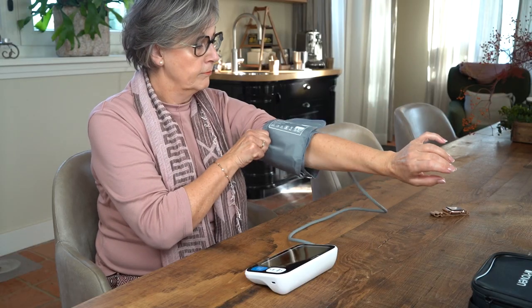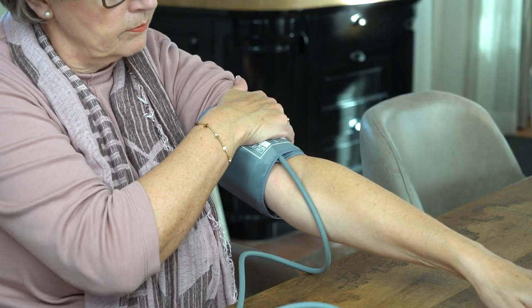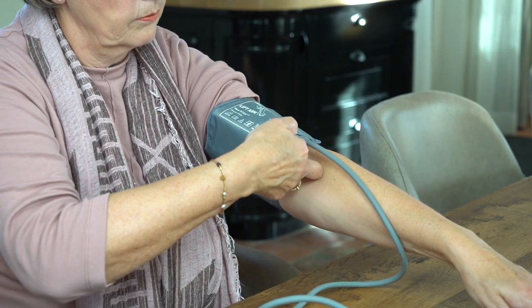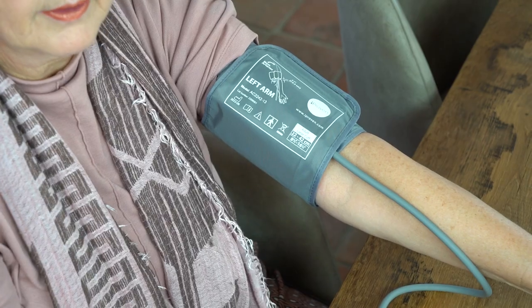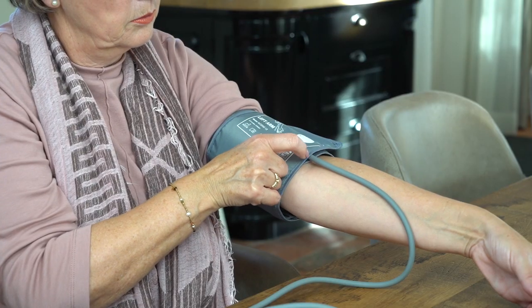When taking a measurement, correctly wrap the cuff of your BP monitor around your left arm, one inch above the elbow, making sure it is at heart level. Make sure the cuff fits snugly, but not too tight. Align the tube with the main artery in your arm.